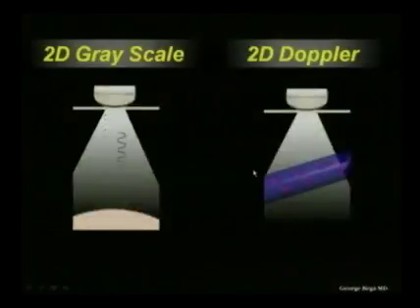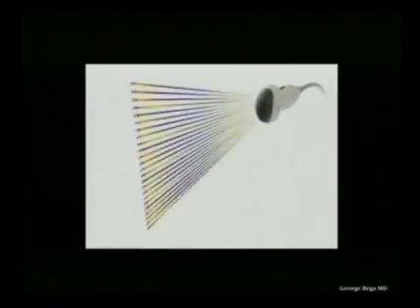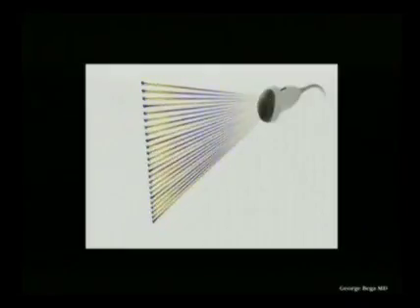So how is the ultrasound being obtained? Well, simple. Basically, a transducer element will send a pulse down and it comes back. Obviously, in the Doppler, it will pick up the frequency shift. But as you can see, the beam is emitted from the transducer elements down vertically and up. So here is a diagram, this is an animation of a probe. As you can see here, the transducer elements will send an ultrasound pulse in the periphery, and of course it receives it back and it measures the round trip time.